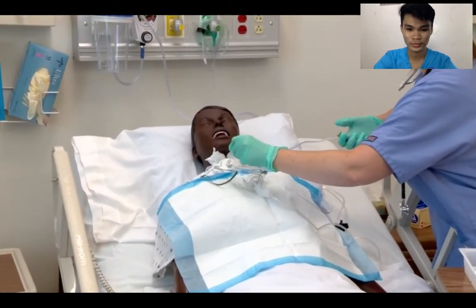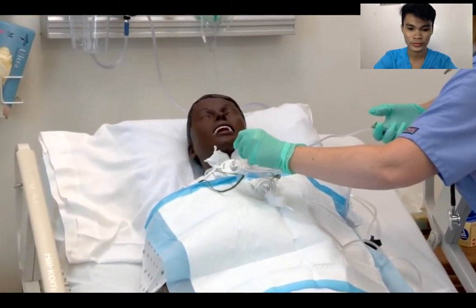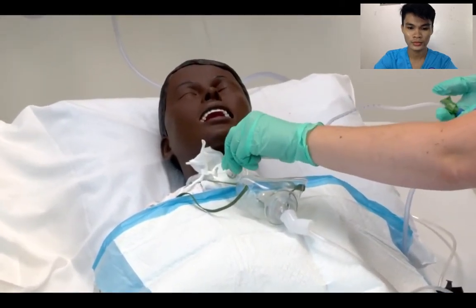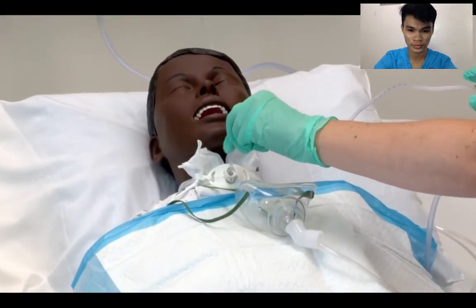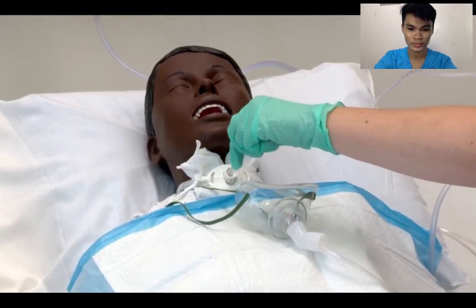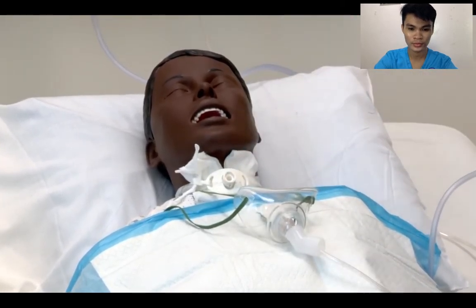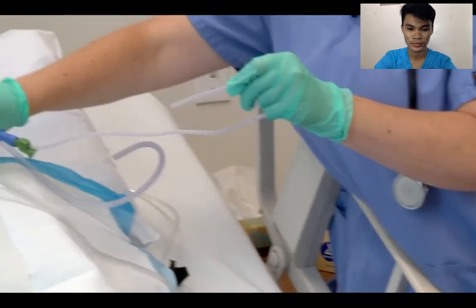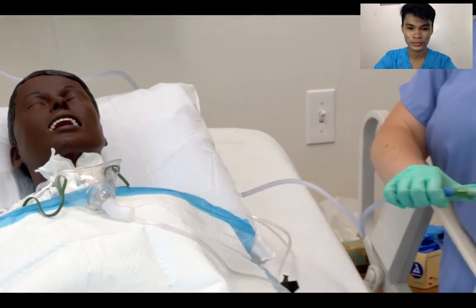Now, remember, we're not applying suction as we go down, but on the way back up. So I'm going to insert the catheter. I feel a little bit of resistance. Going to suction as I'm coming up with some circles. Okay, I want to apply the oxygen again. I'm going to clear my catheter.